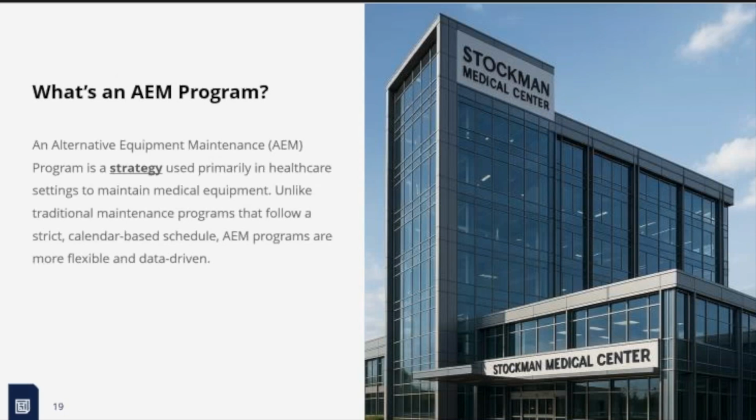Say that again? Are there certain types of equipment you cannot have in an AEM program? The answer is yes. We do have a slide for that later on down the road, so we will talk about that. There are some things where it's like, nope, you can't, you have to do OEM on these ones. We'll have some examples of those later on.